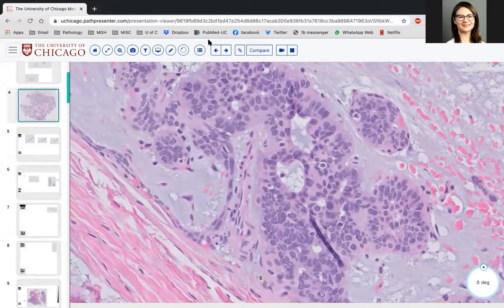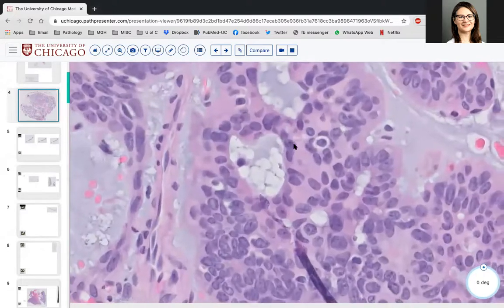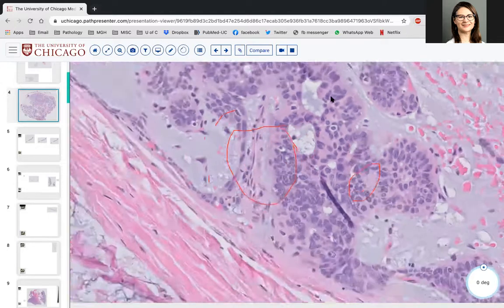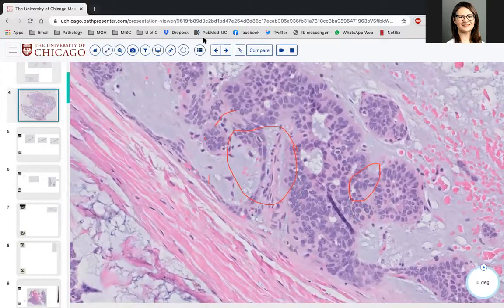As you can see here, at least focally, there are these more eosinophilic epithelioid ductal cells with scattered myoepithelial cells at the periphery, even though it's not perfect here. I think we do see punctuation. Oh, here's another one. There is punctuation by these ducts. Therefore, it is a true biphasic salivary gland neoplasm. Therefore, it is a pleomorphic adenoma.